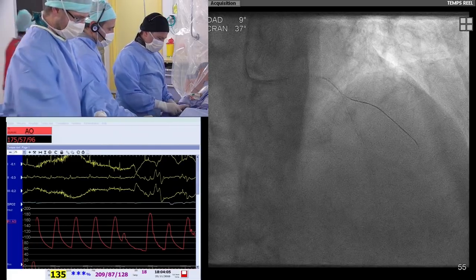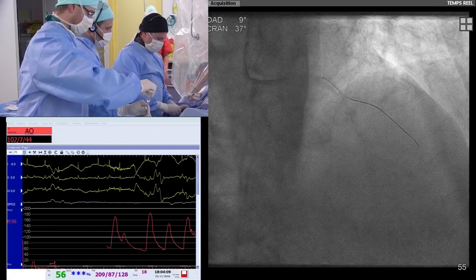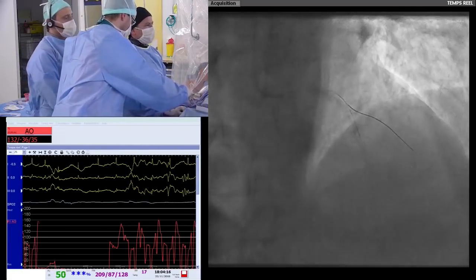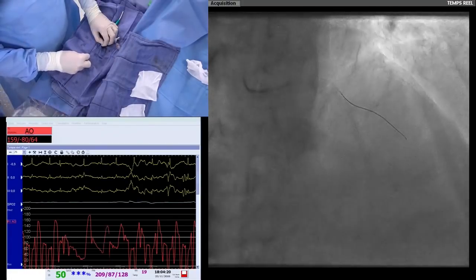So I use a long stent. I repeat the size. Diameter is 4.0 and the length is 48. To better place the stent, I can use stent boost.